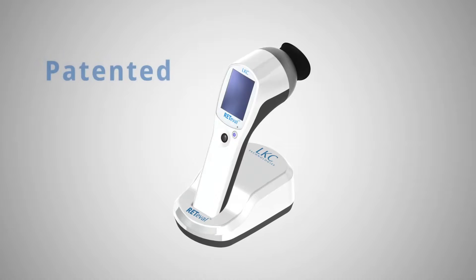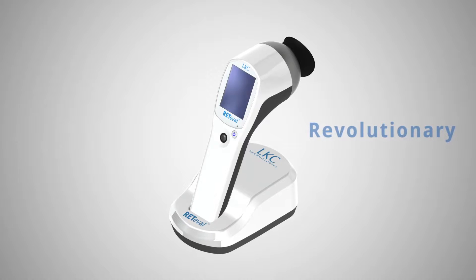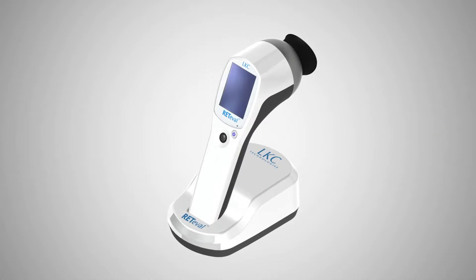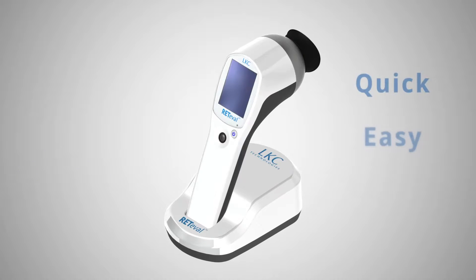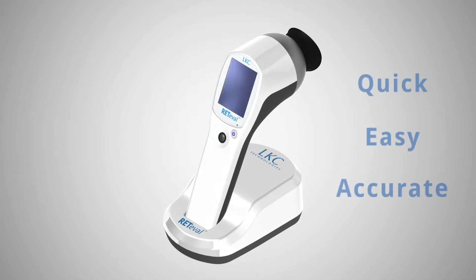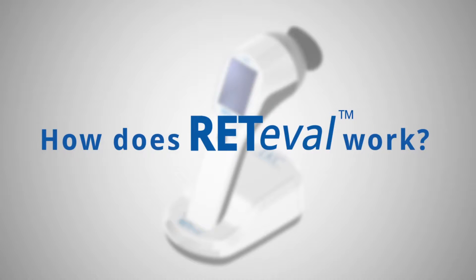Reteval is a patented transformational technology designed to revolutionize the identification and management of diabetic retinopathy. This inexpensive handheld device provides quick, easy, and accurate assessments of the presence of sight-threatening diabetic retinopathy. So, how does Reteval work? Here's a brief demonstration.